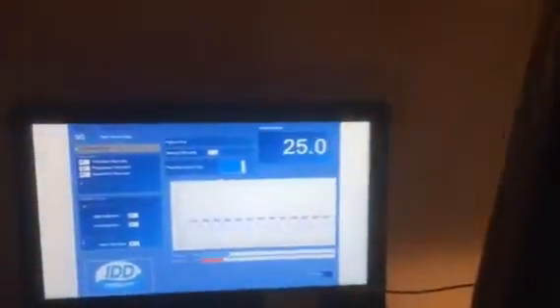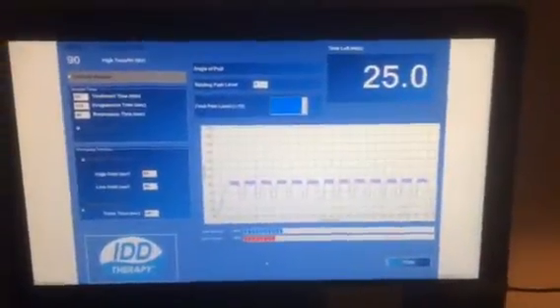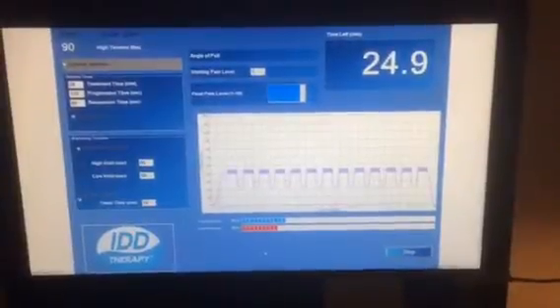We have a live tracking on the screen on the computer, which is for the tension, but the interesting thing is what's going to be happening to the muscles of a patient during treatment. Andy has just made an observation. We've just started the treatment, and the question is, are we actually going to see anything? So Andy, what were you saying? What are we seeing on the graph?